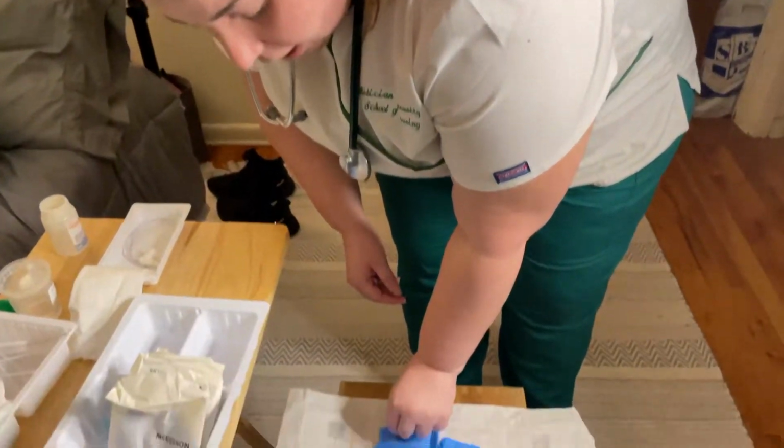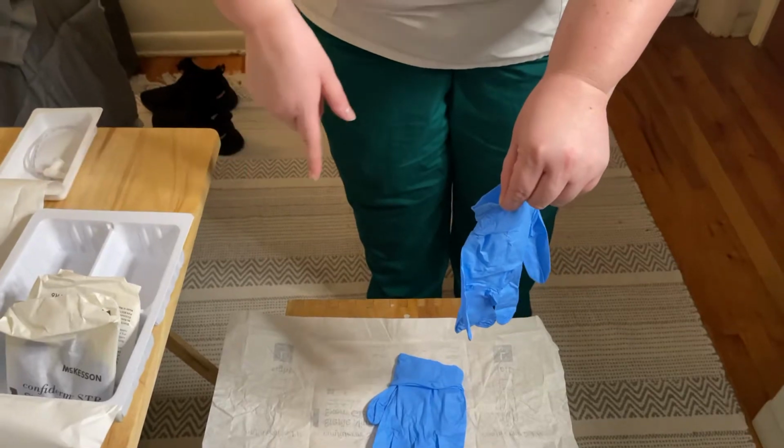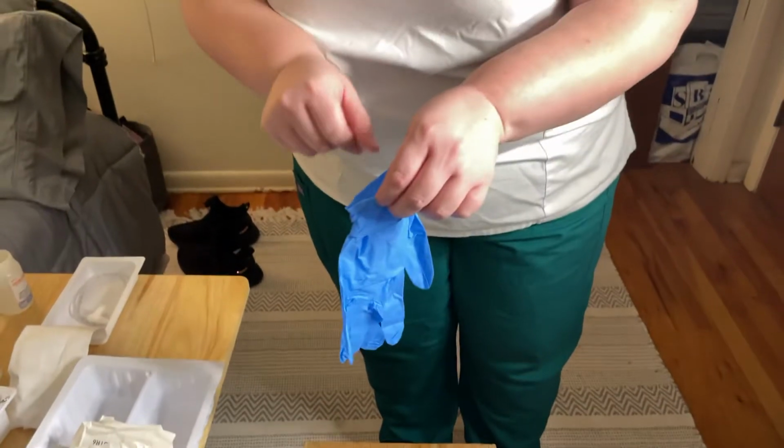So when I'm putting sterile gloves on, I'm going to grab by the cuff. I'm going to make sure that I touch only the outside of the wrapping, up to 1 inch from the edge, to maintain sterility. I'm going to grab the inner cuff.